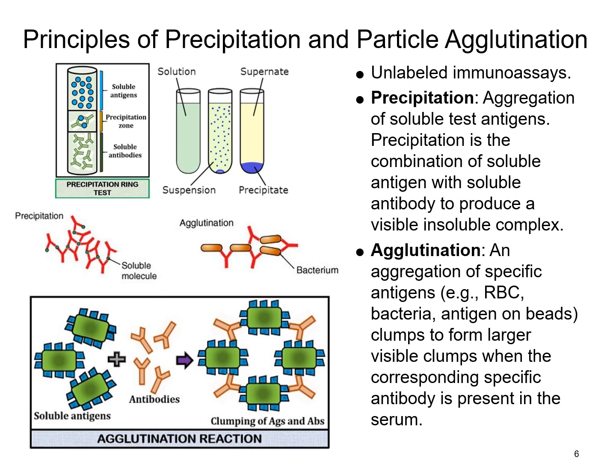So with your precipitation, again, you do have those soluble antigens as well as those soluble antibodies that are in that sample, and then they're going to come together. So you see here where this precipitation reaction here in the center kind of demonstrates how those come together and start kind of bridging together and then forming a particle that's actually visible. So you start off with your suspension, and then depending on the test conditions, whether it's an incubation period, or any other factors that may take place, then you're actually allowing time for those antigens and antibodies to come together. And then what you're looking for is some type of precipitate where they just kind of come together. If you've ever had milk spoil in the refrigerator, and you see how over time those particles start to aggregate together, and then you have this separation that takes place, that gives you the visual of what's happening here.